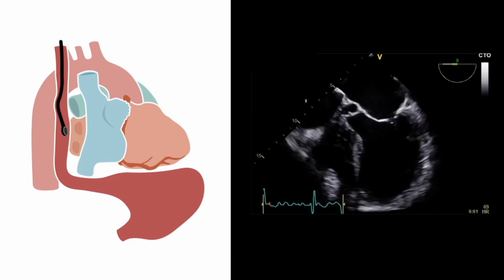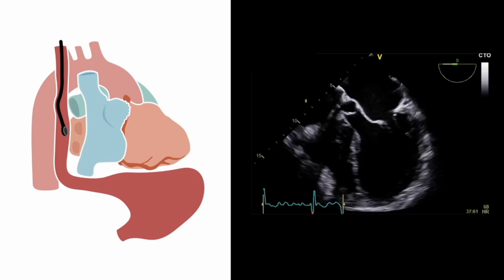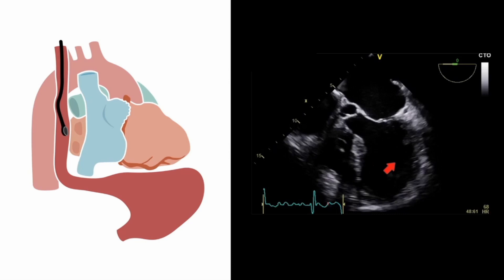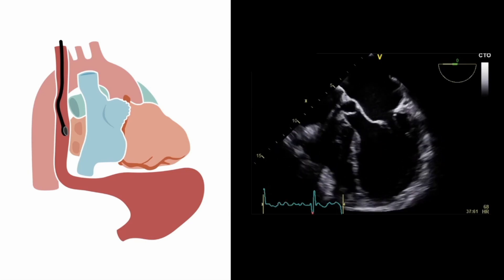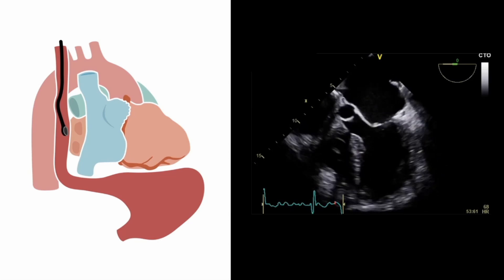When we start off with our view initially, we tend to get a five-chamber view rather than a true four-chamber, because in addition to the two atria and two ventricles in the image, we also have the aortic root, aortic valve, and left ventricular outflow tract. We want to eliminate these from the image to get a true four-chamber view.